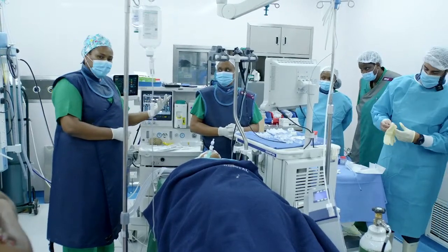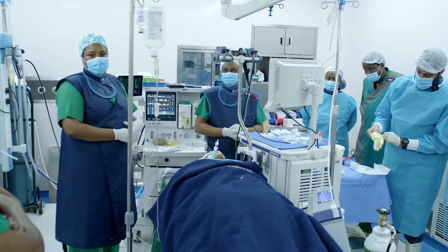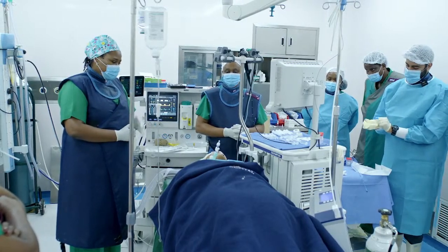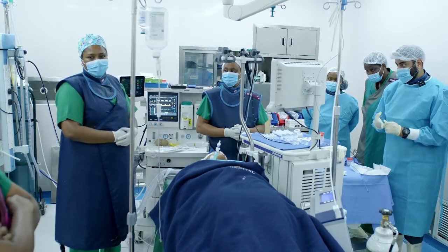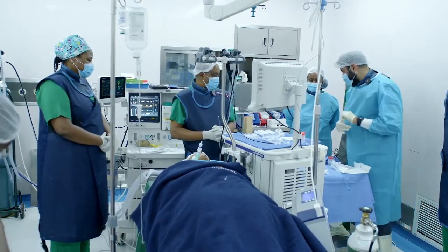We have the same kind of setup actually. From the anesthesia side, we use IV. They will have it distributed locally. They have the adrenaline. I have my resuscitation drugs ready. And yeah, so we just keep an eye out, make sure we don't have any complications. This being our third, I think so far so good. Okay, I'm going to step over there.